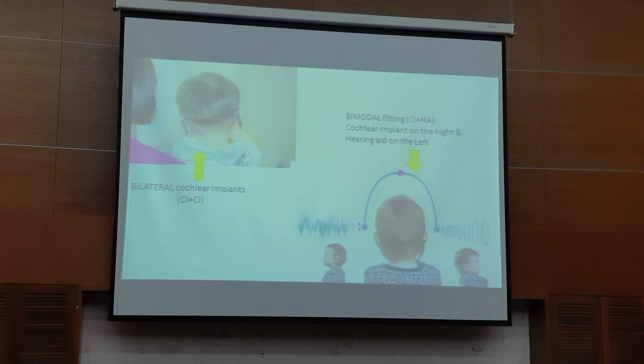Bilateral is when you use two. We call it bimodal if you have one cochlear implant and a hearing aid on the other side.